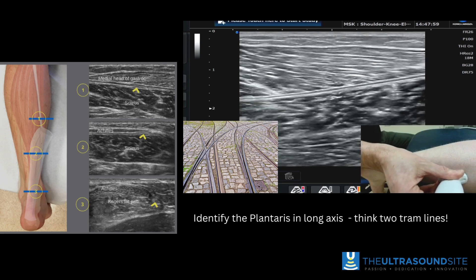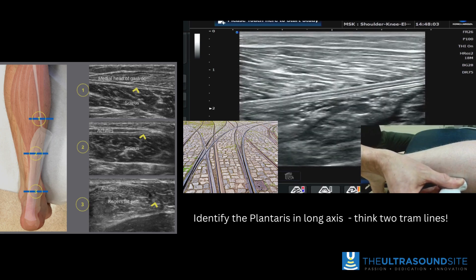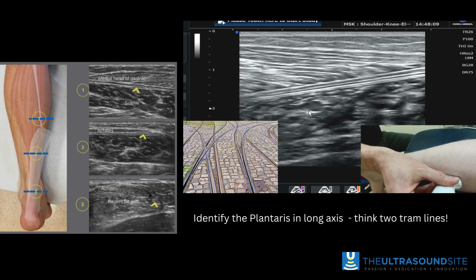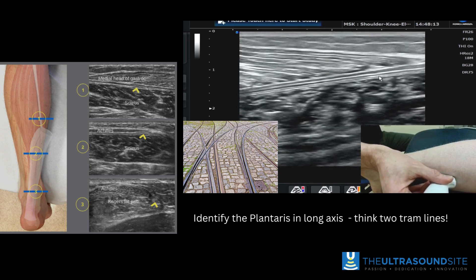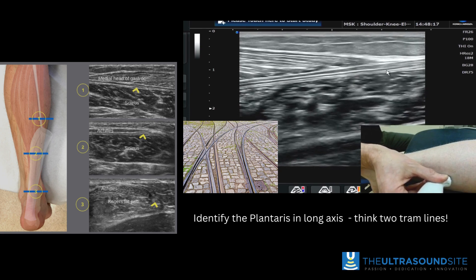It's also worth noting that in a long axis view, it's important to be able to identify the plantaris. Where the plantaris is positioned, you'll see a double tram line appearance of two hyperechoic lines, and one of those is the plantaris tendon, which you can then follow distally. It sits adjacent to part of the free gastroc aponeurosis that starts to form more distally.